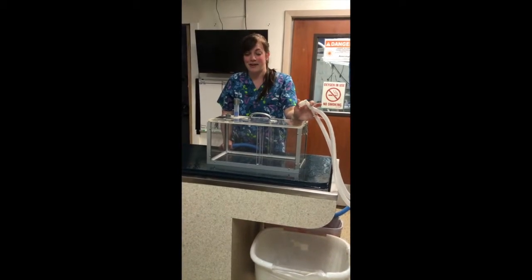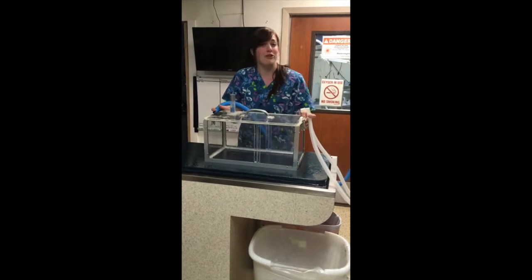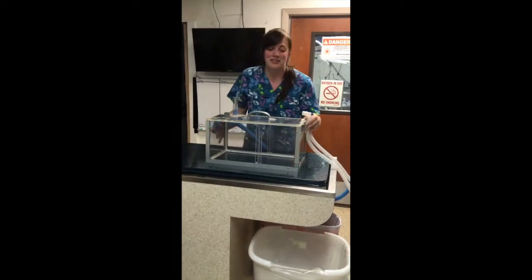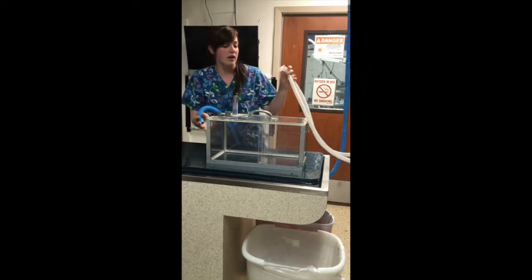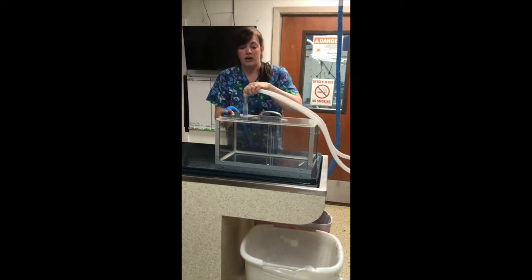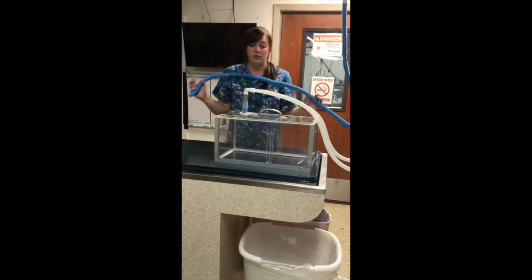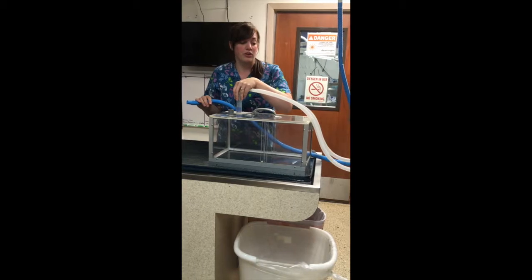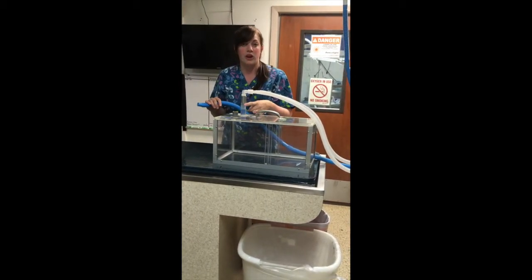All right, I'm going to be talking about induction chambers. So I apologize, ours is old, we don't use it, but I'm going to demonstrate and explain how you do use it. So when you're using an induction chamber, you have two ports on the top. One is where your gas is going to enter the chamber. So all your anesthetic gas and oxygen is entering through this port into the chamber.